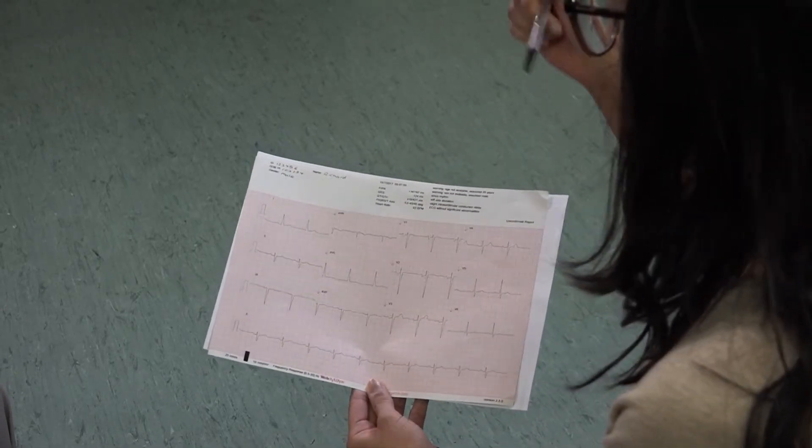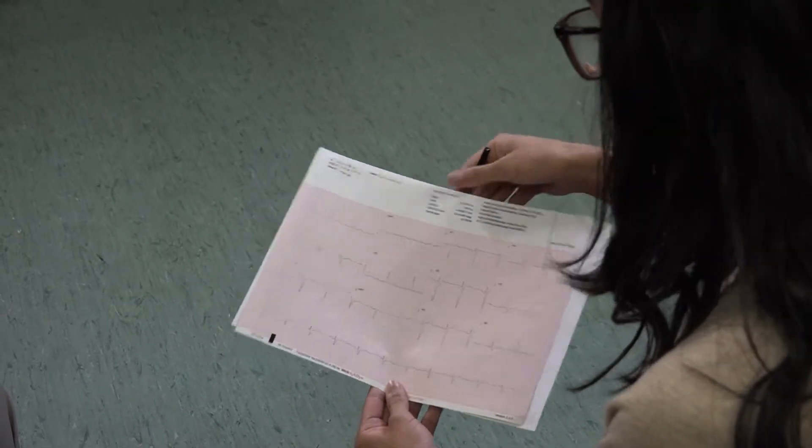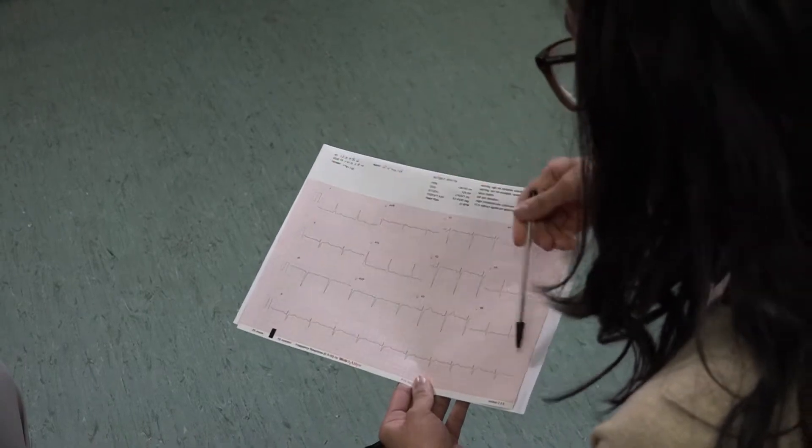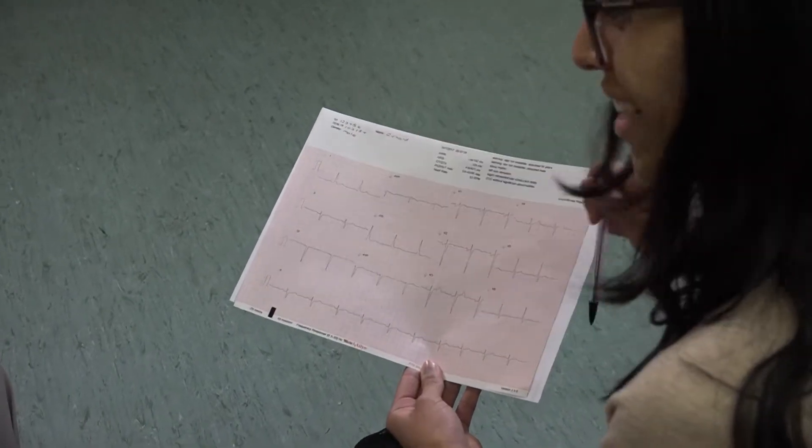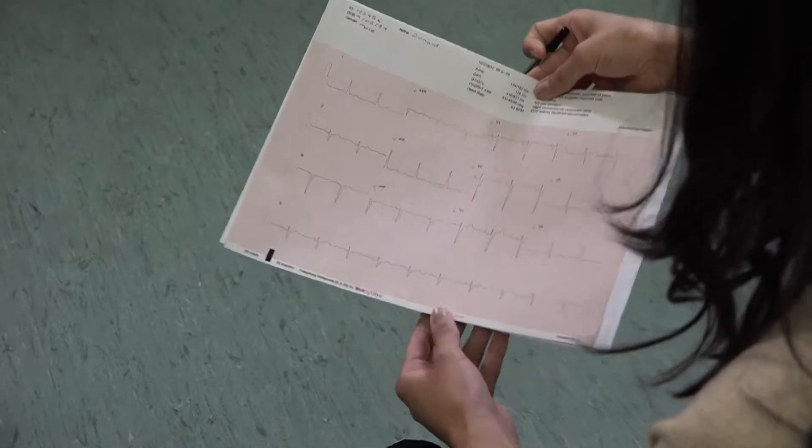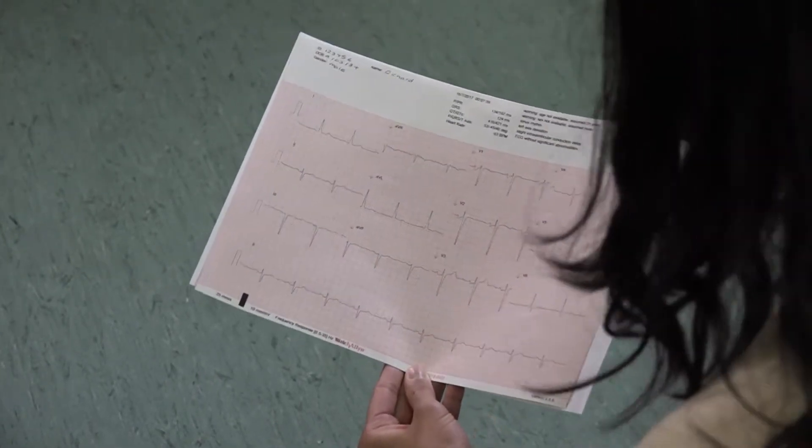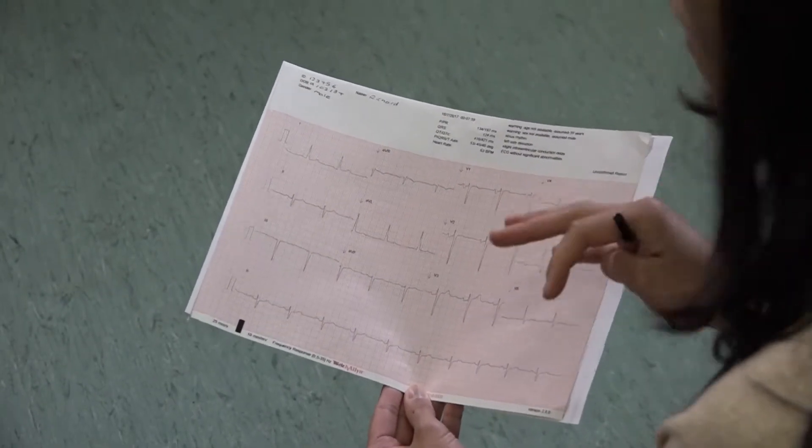The next thing you want to move on to is having a look at the rhythm of the ECG. The best place to look is right at the bottom, your rhythm strip, which is normally lead two. If on sort of a brief inspection it looks quite regular and you're happy with that, that's fine and you can move on.